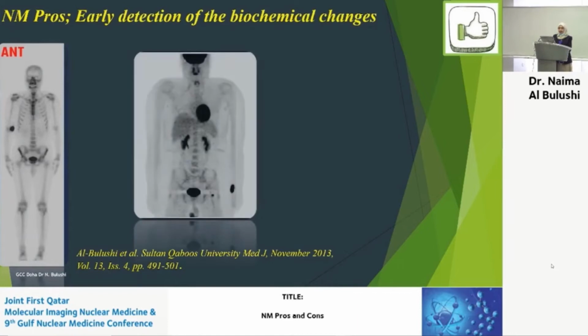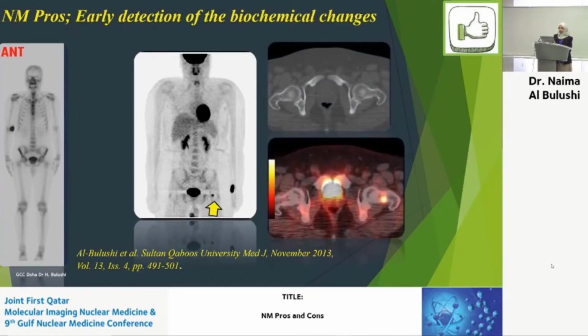Now this is an example of one of the patients that we have published, and this is a group of patients in which the PET-CT has changed the management. For example, this is an esophageal carcinoma for staging with bone scan. And the bone scan was totally reported as negative. As you can see, there aren't any changes that we can report as metastasis, whereas the PET image and the fused PET images are showing very early changes that the bone scan alone could have missed. So upstaging those patients.